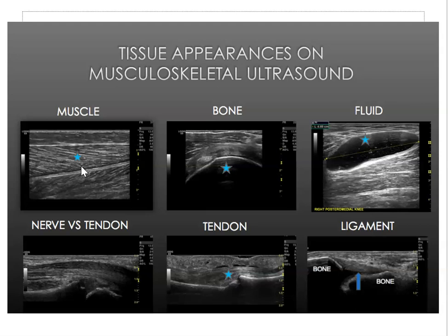A fluid-filled cyst: the sound waves have come in this way, passed through the cyst because there's no reflection going on, so this is hypoechoic. Sound waves have hit the far side of this fluid-filled cyst, and then most of them have bounced back to create a very bright signal, and then some of them have penetrated that tissue, and then you get other reflections as there are different structures going on down here. So all different tissues reflect sound in different ways.